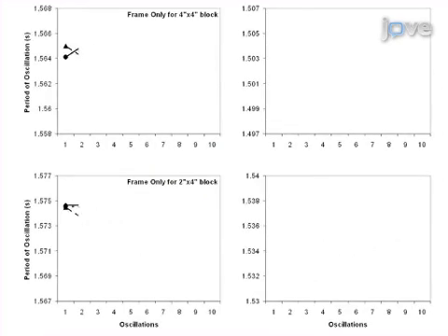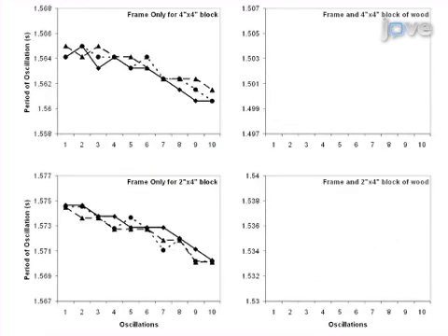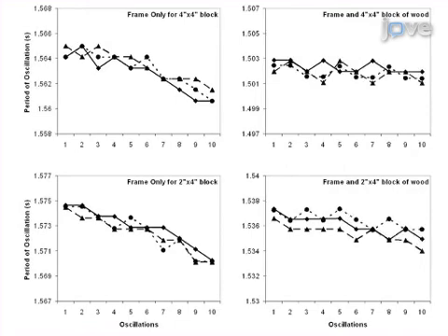Inertial measurements of the cage are subtracted from the measurements of the prosthesis and cage combined to provide estimates of the inertial properties of the prosthesis. The main advantage of this technique over existing methods, like assuming inertial properties of the prosthetic side are similar to those of the intact side, is that the inertia of the prosthetic leg is more accurately represented in the biomechanical model of the person.